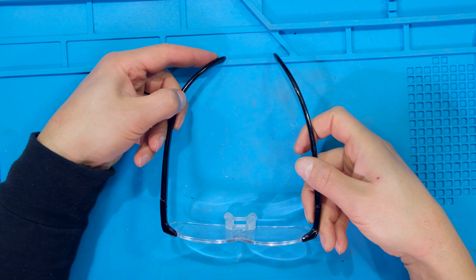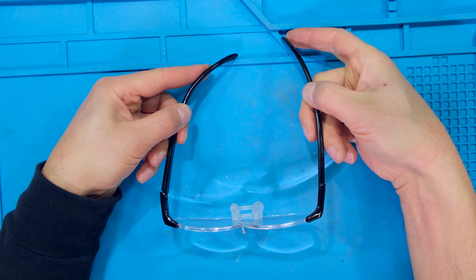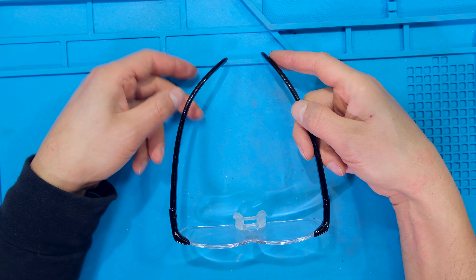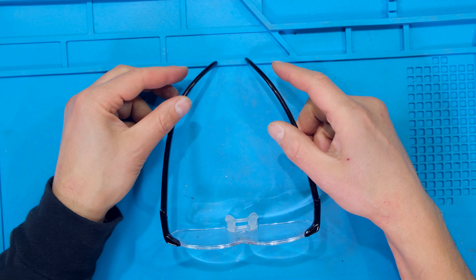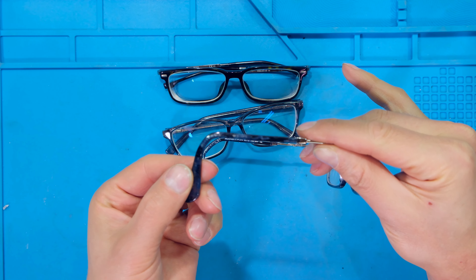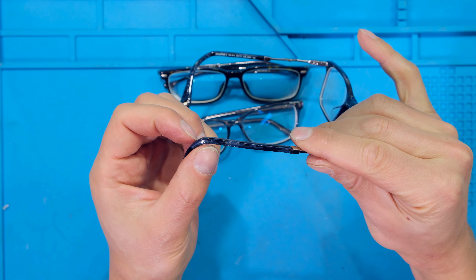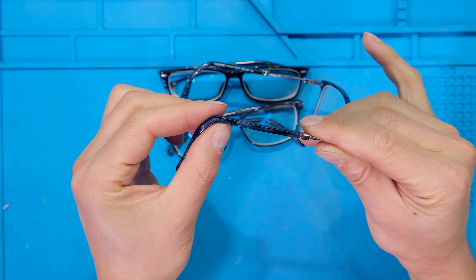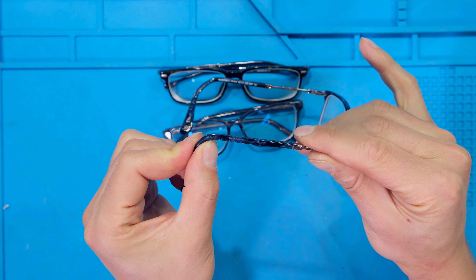The next tip: just be careful of bending it too much. You might find that you're checking one side and it's perfect, but that's only because the other side is open, and the minute you bend the other side it's way too tight. So bend one side a little bit, put it on the subject, check the curvature, and then bend the other side a little bit — if it needs more, bend one side then the other. Some people want it wrapped right around their ear and really tight, but when heating up just be careful because if you bend too aggressively you might deform or even tear the plastic. Heat it up, bend a bit, do the other side, let it settle, then heat and bend some more.